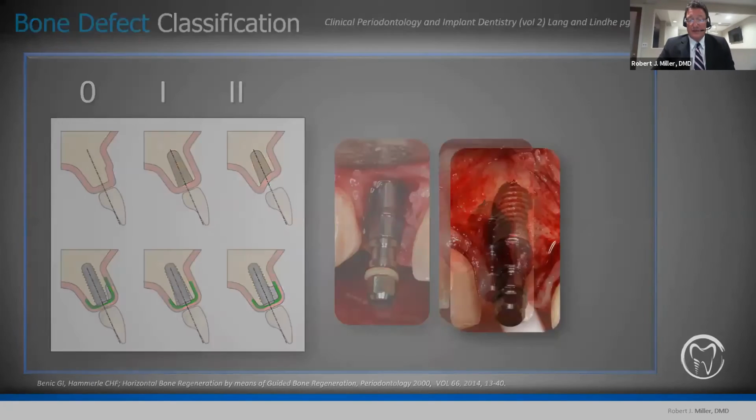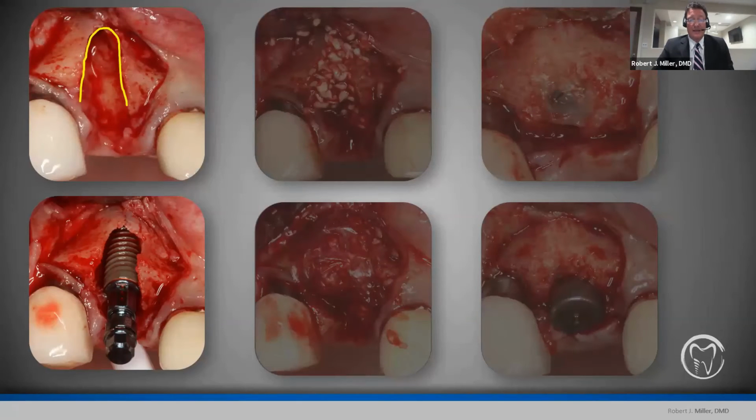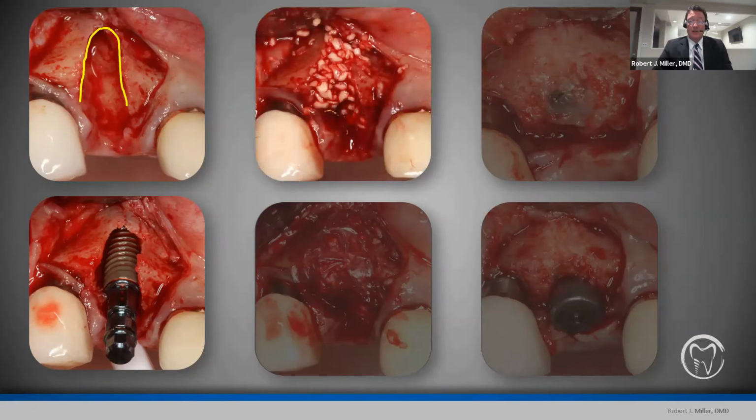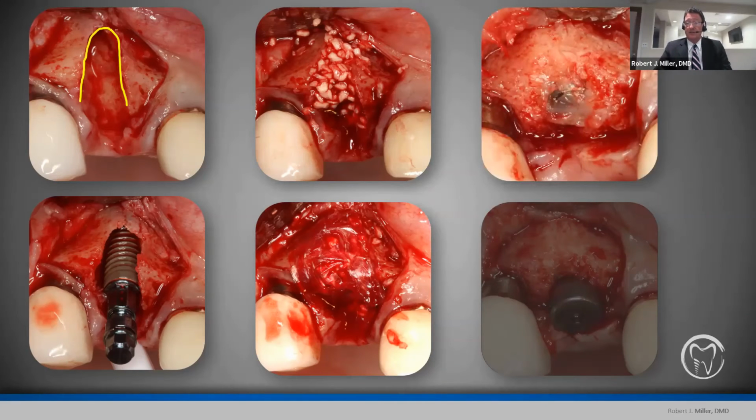Now, type 2 defects, you can see that we have a little bit larger dehiscence type lesion. And again, if the implant can be placed in a prosthetically guided or restoratively driven position, you can very much feel comfortable doing this in a single stage approach. Cuspids are sometimes kind of tricky, but this particular case, we were able to negotiate this. Again, I like to use an allograft in these situations. The BioXclude membrane works perfectly in these environments. Very easy to use and extremely predictable, as evidenced by this complete regeneration of that buccal plate.